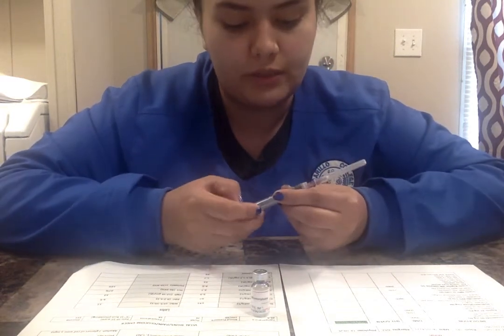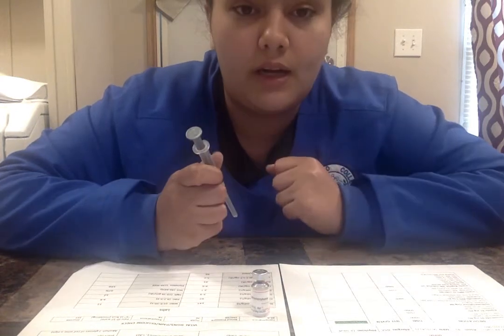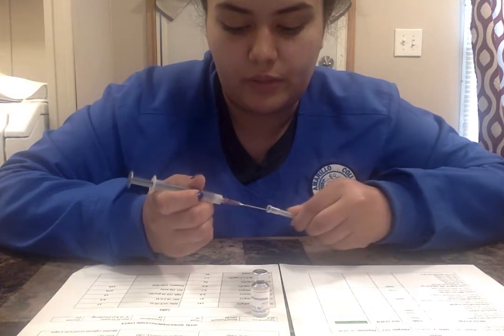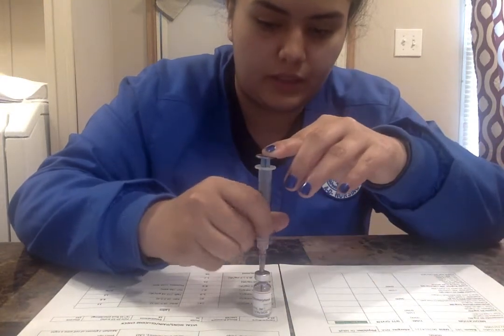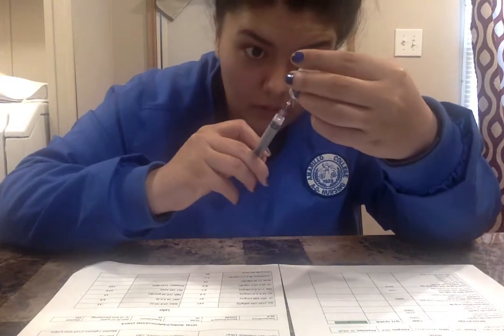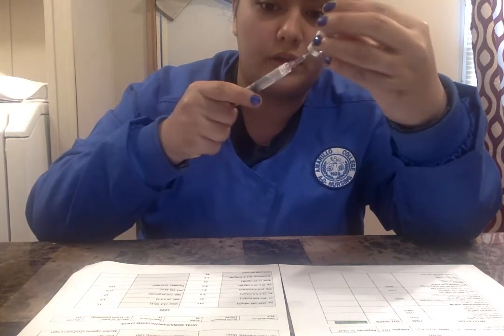But I'm going to go ahead and draw up 1 milliliter of air to inject it into the vial. But if this were a glass ampule, I wouldn't need to do that, because it would just be open. So I'm going to open the needle like this. I'm going to go ahead and put the air in at this time. I'm going to invert my needle, and I'm going to draw out my 1 milliliter of medication.